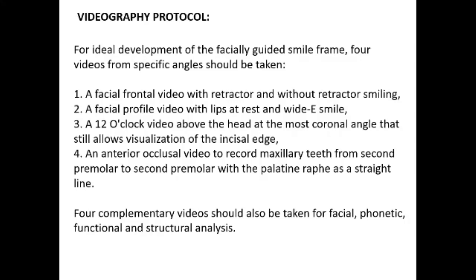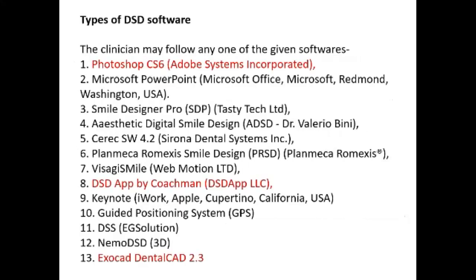So 4 complementary videos should also be taken for facial, phonetic, functional, and structural analysis. This is about the generation 6 of digital smile design, and still people are trying to master this. And if done properly, this videography protocol can help you visualize the treatment protocol in a big way.